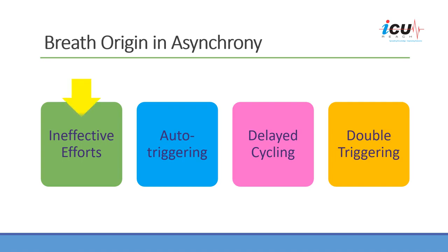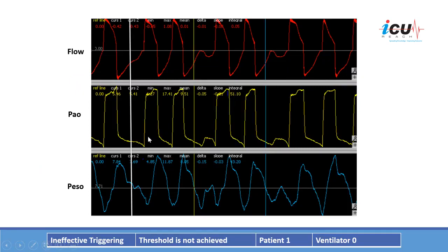The first type is ineffective efforts. We will look at three different graphs: flow over time, pressure over time, and esophageal pressure over time. We will start by looking at the esophageal pressure over time.